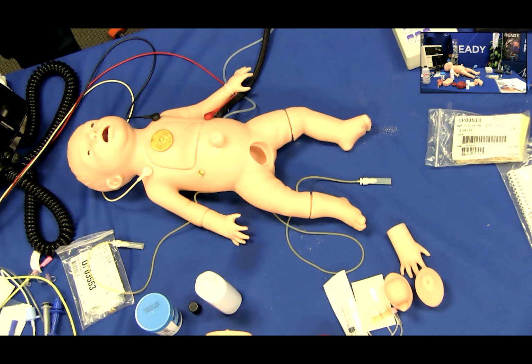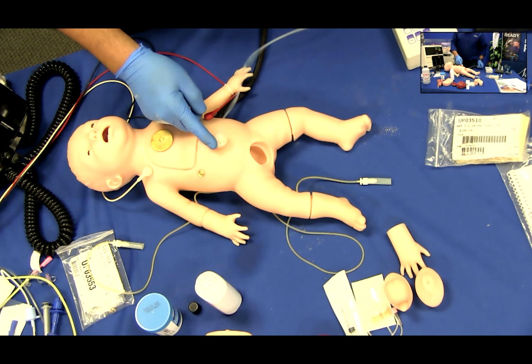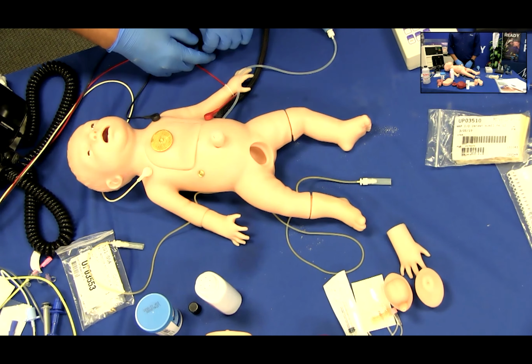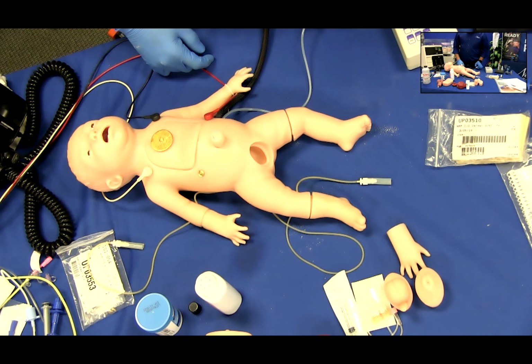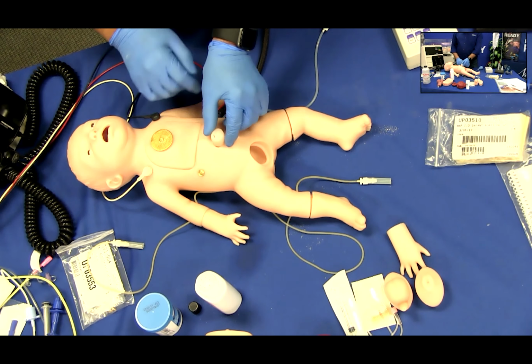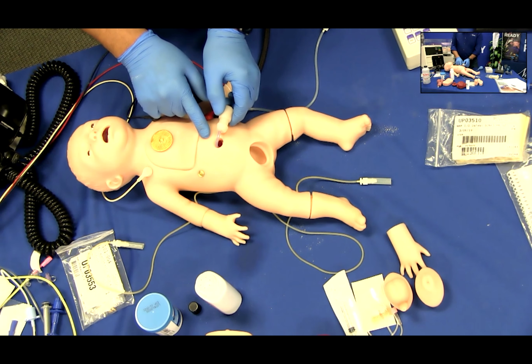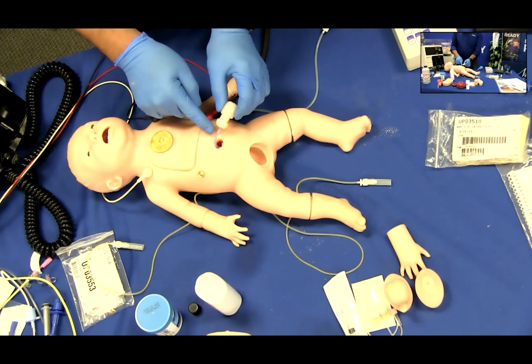Patent umbilicus. The umbilical stump features a patent umbilical vein and 1 patent umbilical artery. Up to 5 milliliters of fluid or simulated blood may be infused into or withdrawn from the umbilical reservoir through either vessel. To fill the reservoir within the abdomen, gently pull the umbilical stump free from the abdomen of the infant simulator. Be cautious not to disconnect the pulse system.